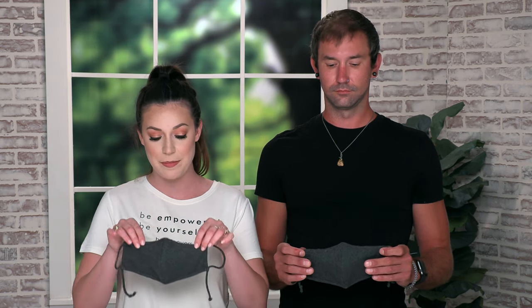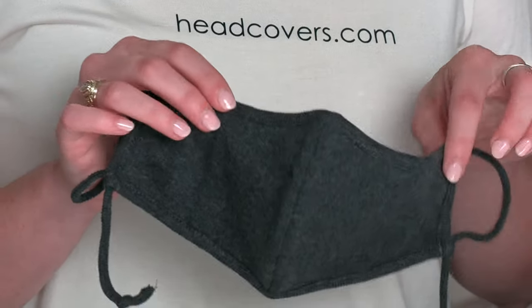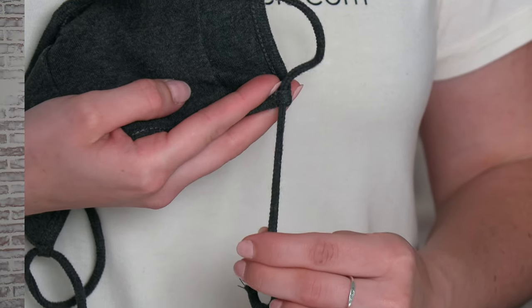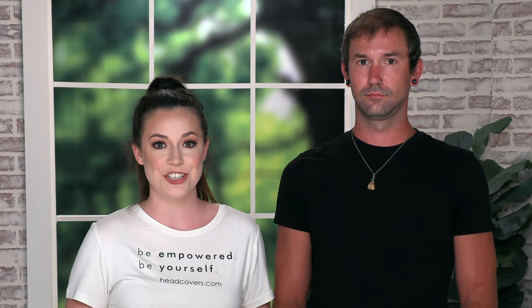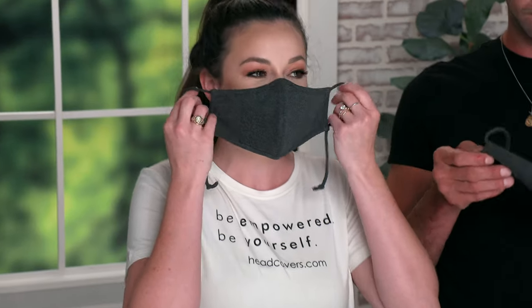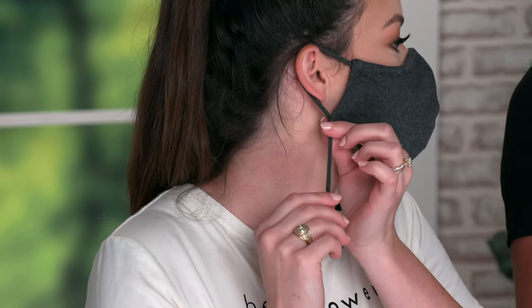First, I'm going to show you the proper way to put it on. I have the mask placed on my face with the pointed side up to cover and contour to your nose. I also have the strings at the bottom for easy adjustment, and this is the side you'll wear against your face. We're both using the average face mask and they're both the same size. To put it on, you'll take the ear bands and place them over your ears with the top facing up, and then you can adjust the ear bands as needed to tighten the face mask.